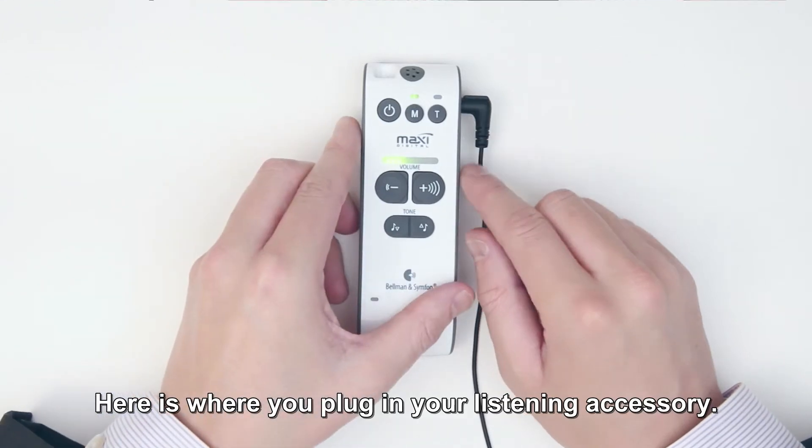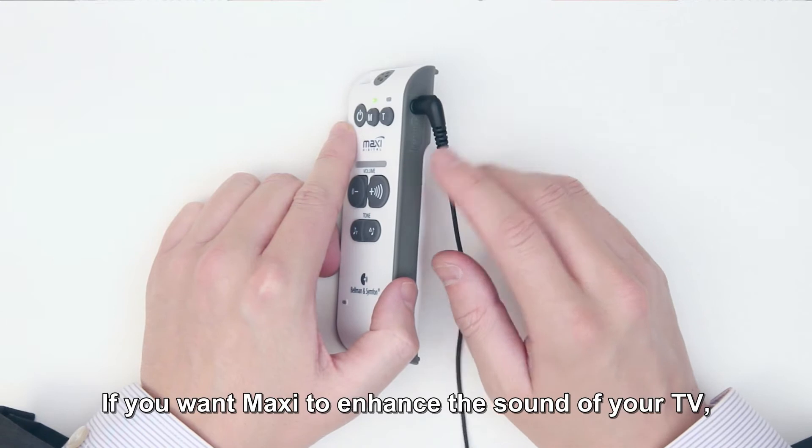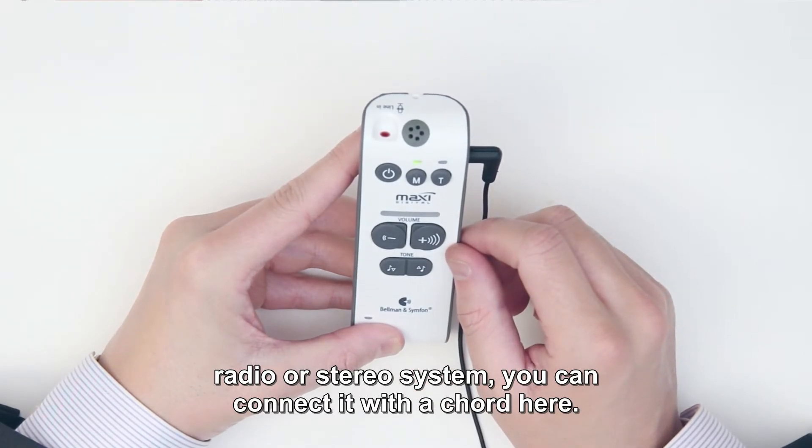Here is where you plug in your listening accessory. If you want Maxi to enhance the sound of your TV, radio or stereo system, you can connect it with a cord here.